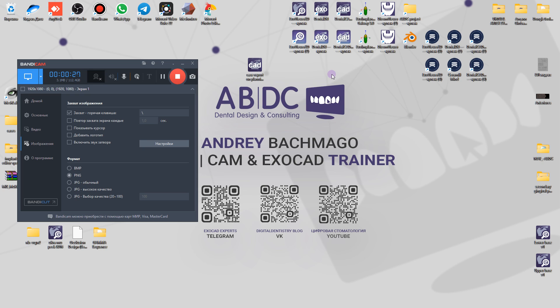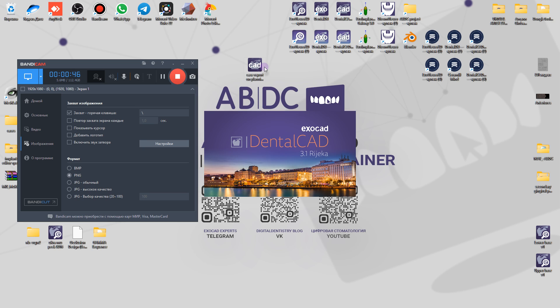This is a full mouth rehabilitation on implants. On the upper jaw we will prepare prototypes, and for the lower jaw let me show you what I prepared. Let's open the DentalCAD file and wait until it opens.